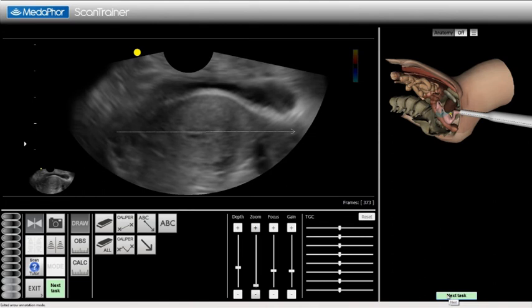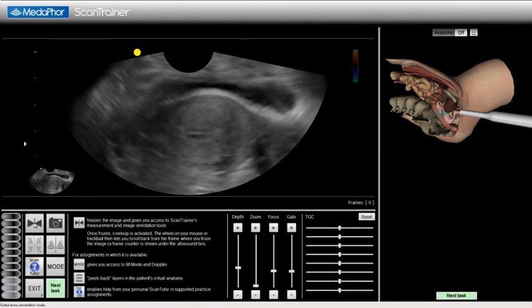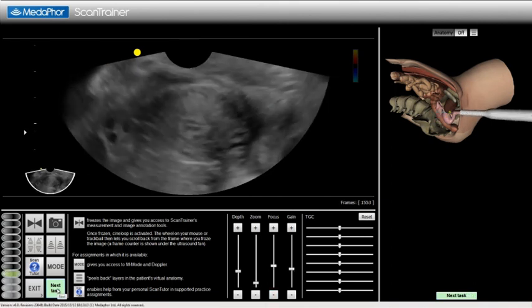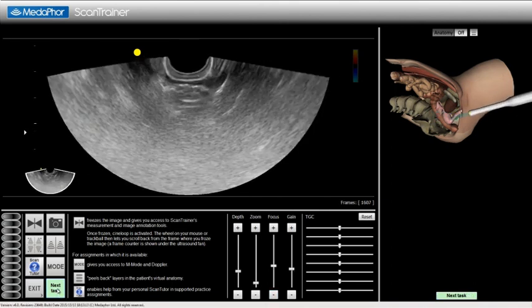Orientation caudal to cephalic. I now draw an arrow on the ultrasound image from the caudal end to the cephalic end of the patient. I then unfreeze the ultrasound image. To complete the scan, I withdraw the probe, taking care not to exert too much pressure on the patient.